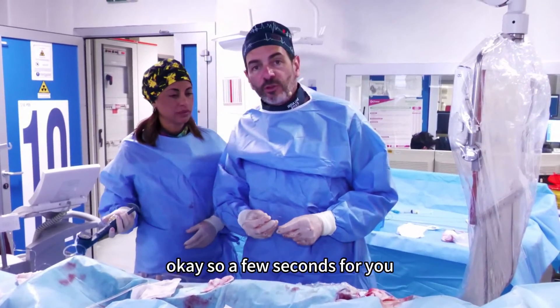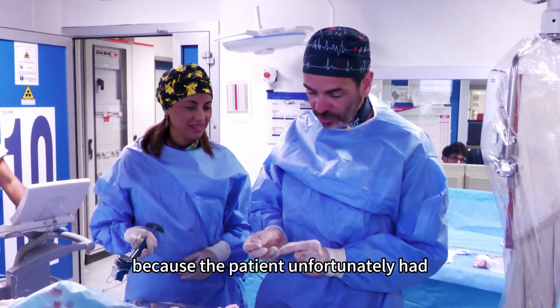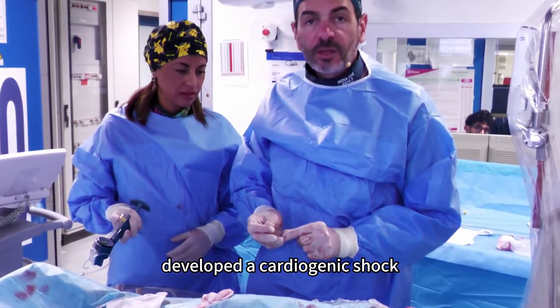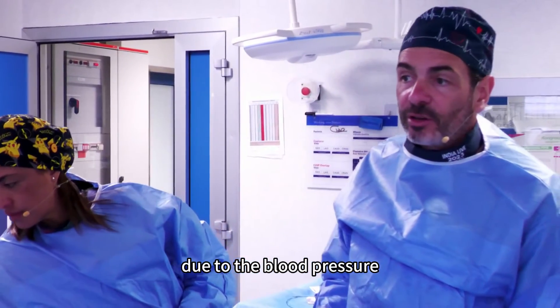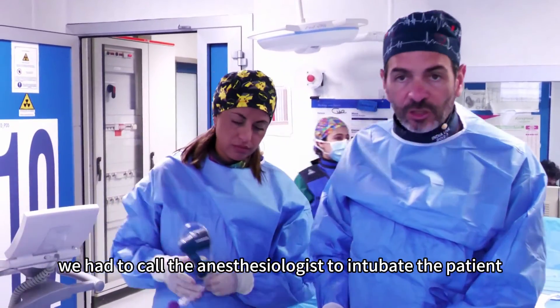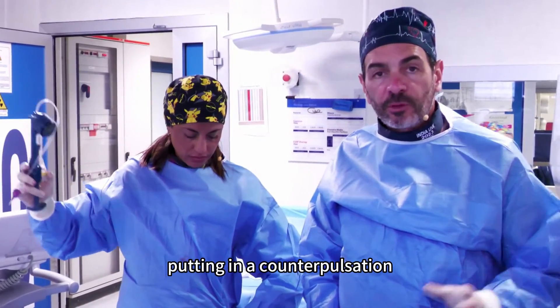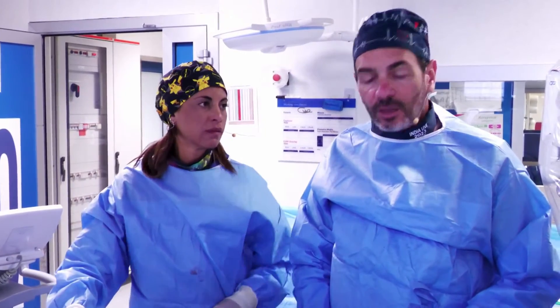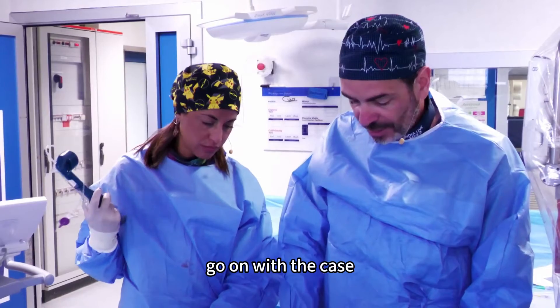What you see in a few seconds took 60 minutes for us, because the patient unfortunately developed cardiogenic shock and then had a cardiac arrest due to blood pressure going very, very down. We had to call the anesthesiologist to intubate the patient and place counterpulsation to achieve adequate blood pressure that allowed us to continue with the case.